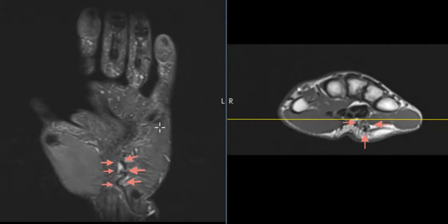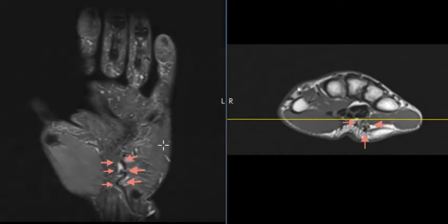we see this section that looks like a coiled vessel with a corkscrew appearance. This is the ulnar artery. Normally this is straight going across here, but when it gets curved like this we think that this may be related to an injury from repetitive microtrauma of this artery.